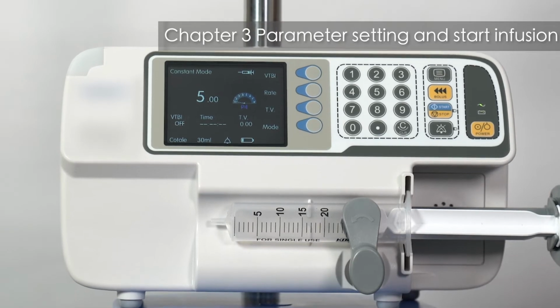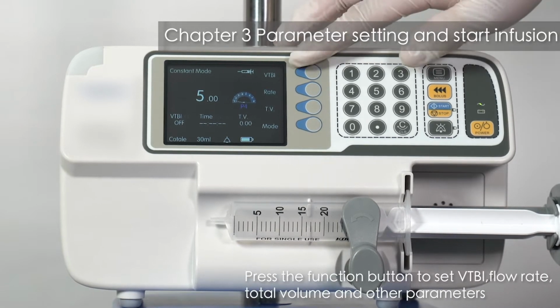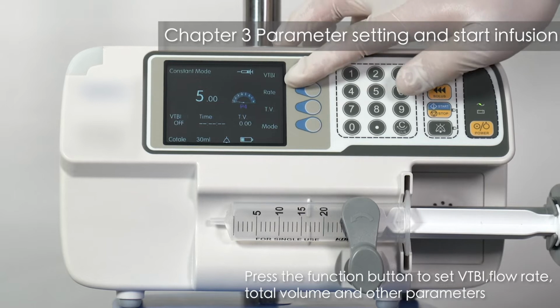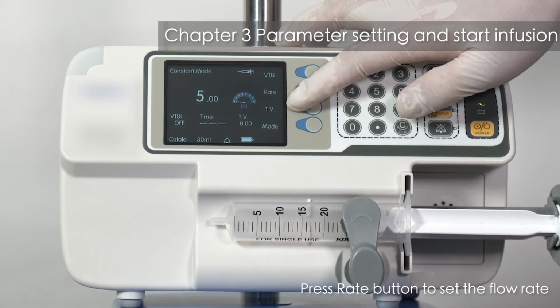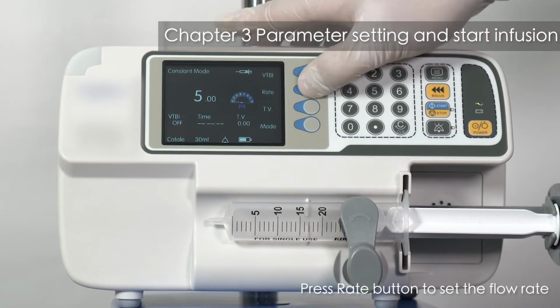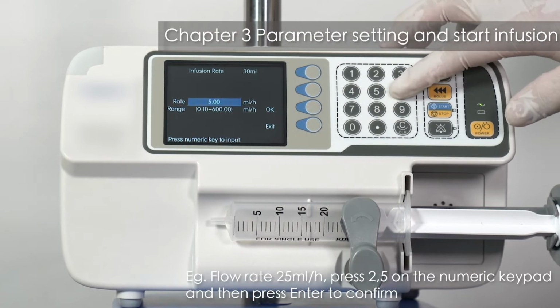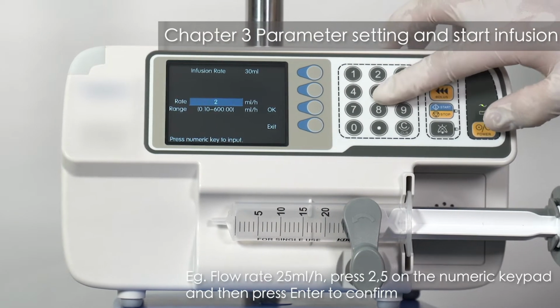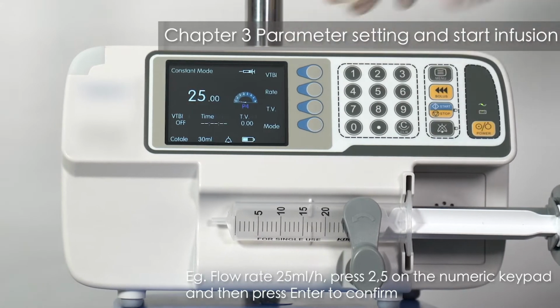Chapter 3. Parameter Setting and Start Infusion. Press the function button to set VT-BI, flow rate, total volume and other parameters. Press rate button to set the flow rate. For example, flow rate 25 ml per hour. Press 2, 5 on the numeric keypad and then press Enter to confirm.